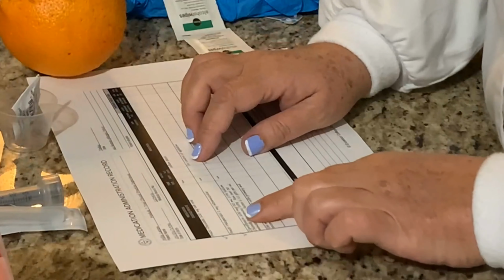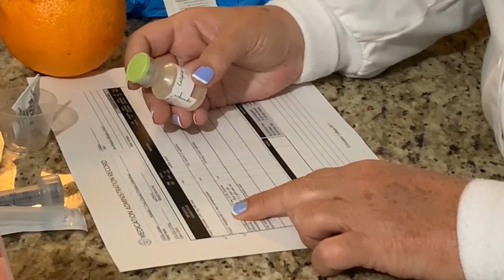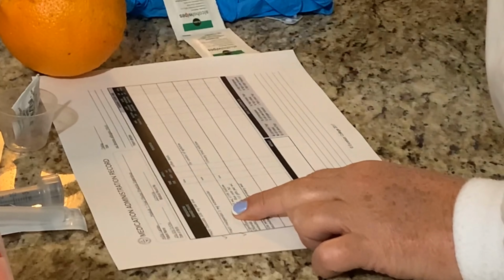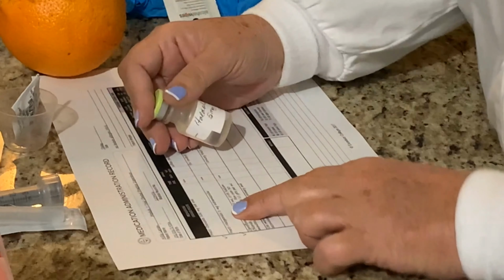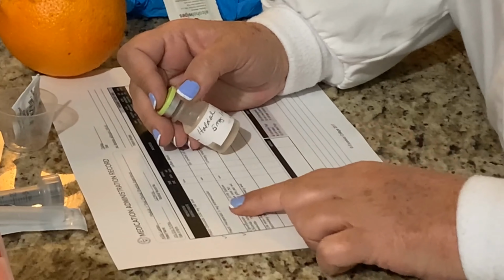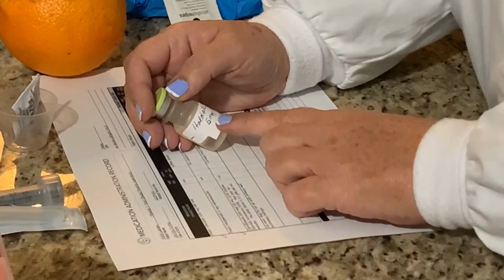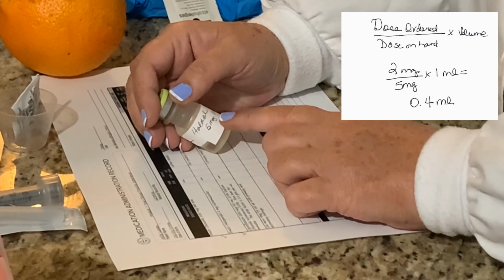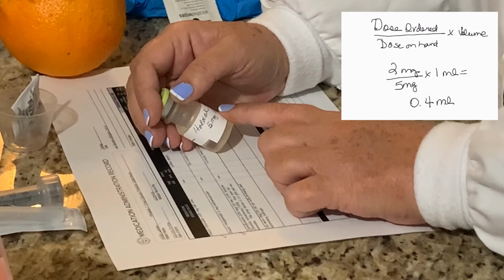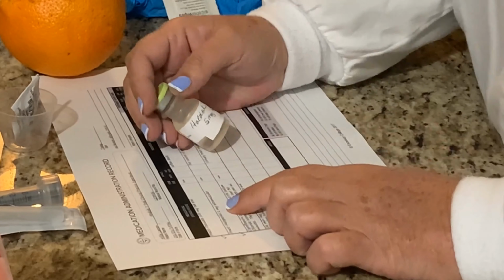Also looking at my Haldol or haloperidol. I'm going to be giving this IM. So I have my Haldol, 5 milligrams per mL, and I'm thinking to myself, I'm supposed to give 2 milligrams. So there's some math here. If I have 5 milligrams per mL, I have to do some math to figure out what I'm going to be giving. So I've done my math, and I'm going to be giving 0.4 mLs of this medication.